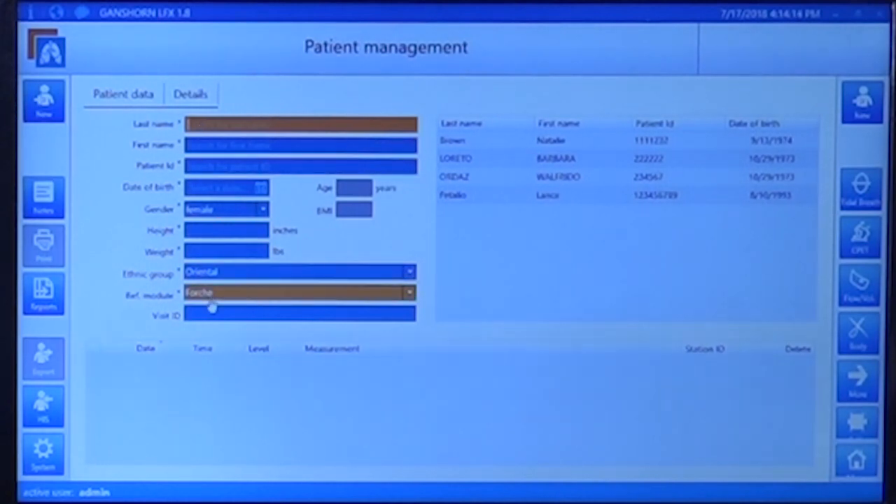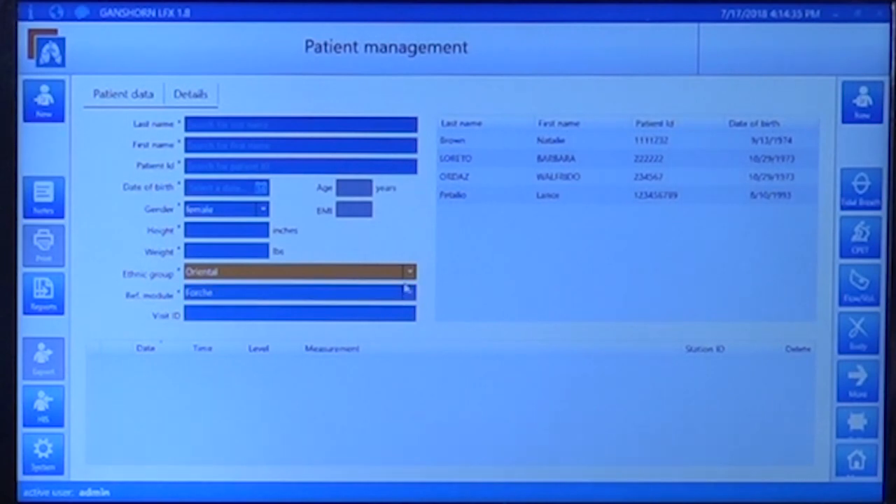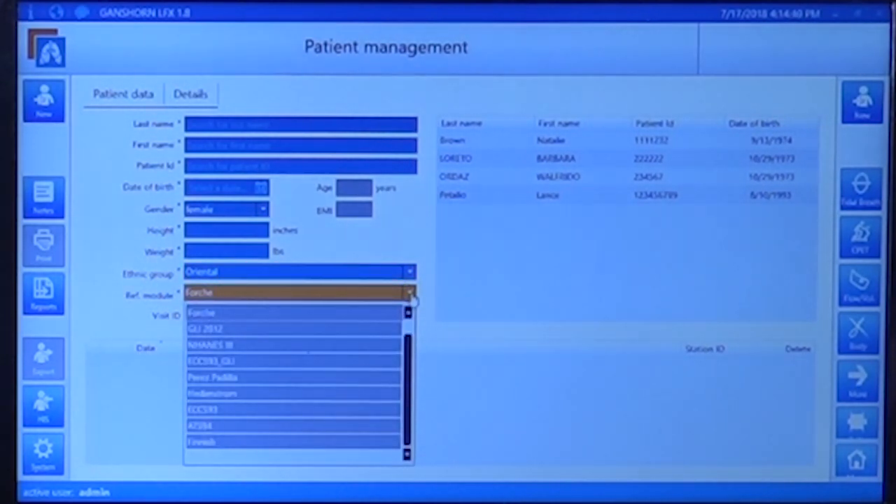All fields are necessary except for the visit ID: last name, first name, patient ID, date of birth, gender (either male or female), height and weight, the ethnic group which can be selected from a drop-down menu, and the reference module or protocol, which can also be selected from a drop-down menu. Here you will find the most common protocols for spirometry and pulmonary diagnostics.